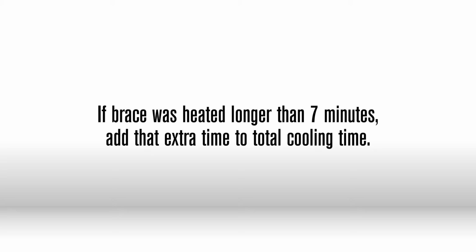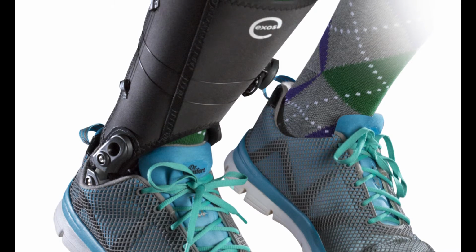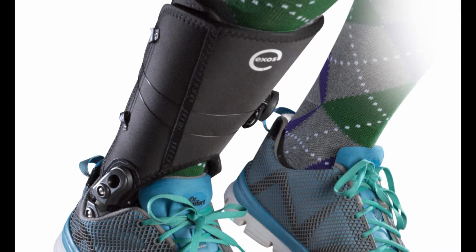If the brace was heated in the Exos oven longer than 7 minutes, you will need to add additional time prior to weight bearing. Allow the patient to ambulate in their new Exos free motion ankle brace.